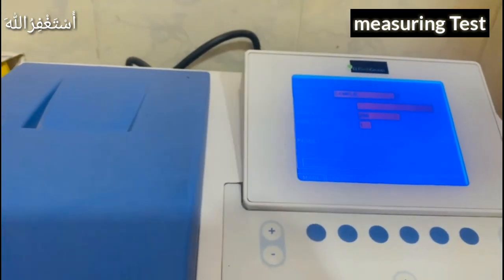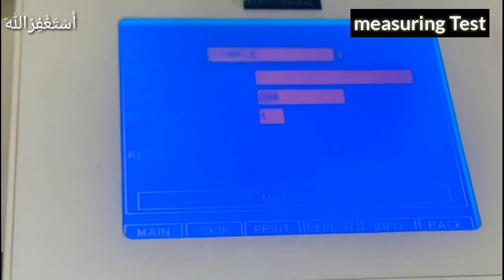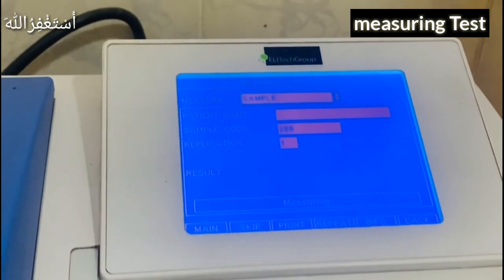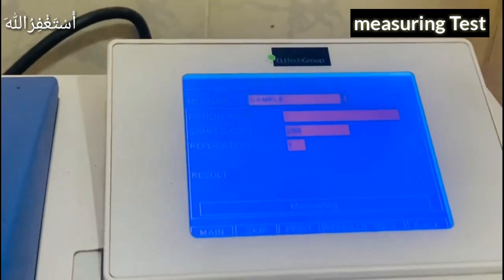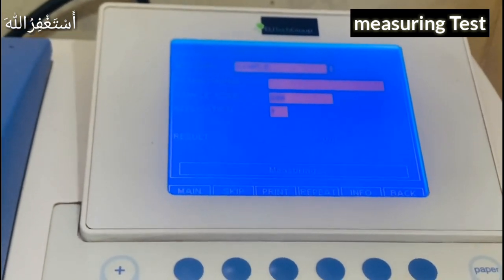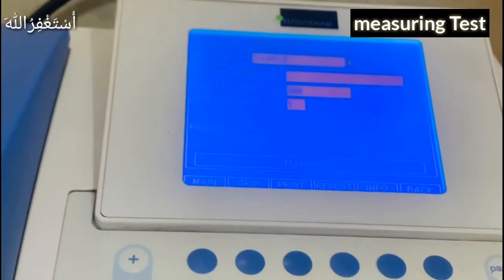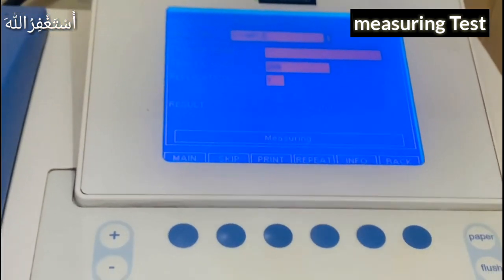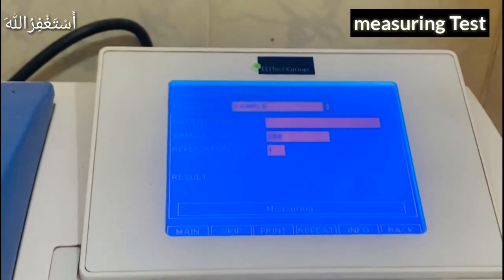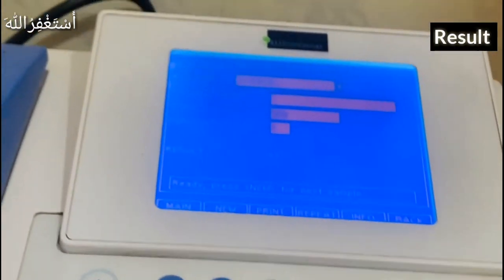The machine is measuring. It will show the result here. Let's wait a few minutes while it measures. You can see that it is still measuring — the result will appear shortly.